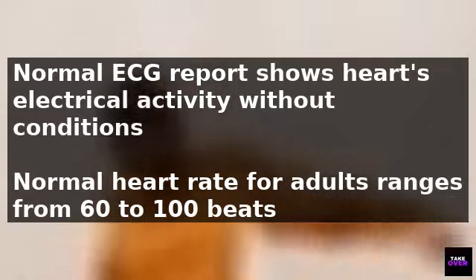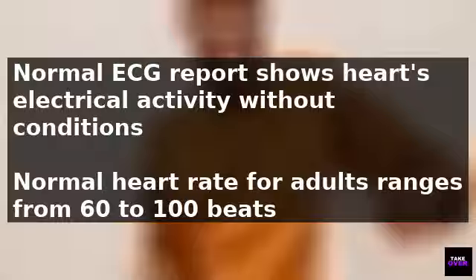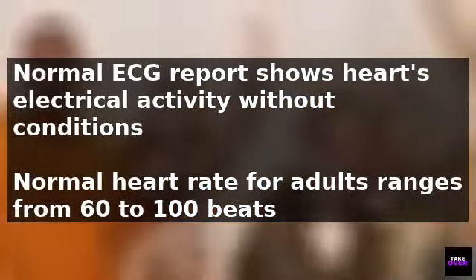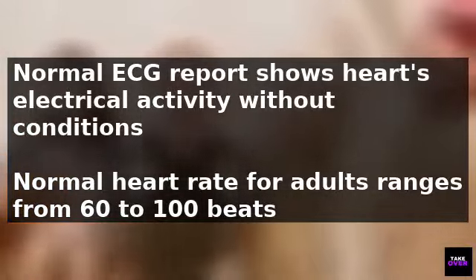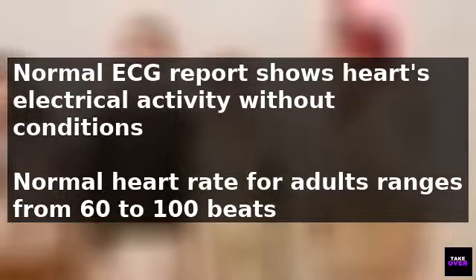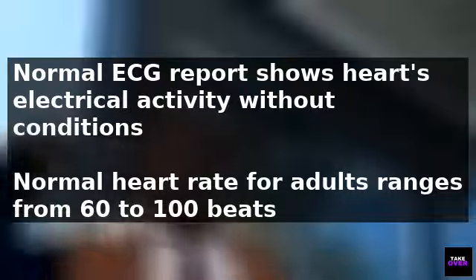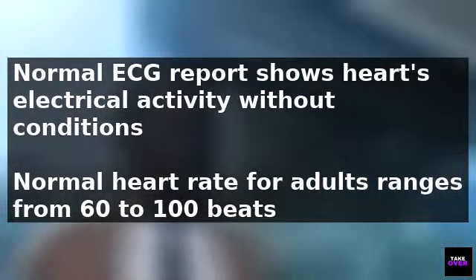To determine if an ECG report is normal, it should show the heart's normal electrical activity without any signs of heart conditions or abnormalities. Checking an ECG report can be a bit challenging, but dividing it into smaller sections can make it easier to understand. First, check the heart rate.